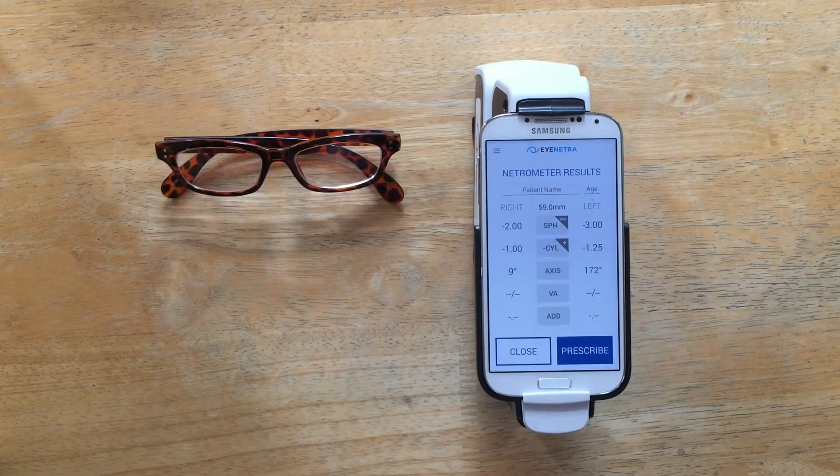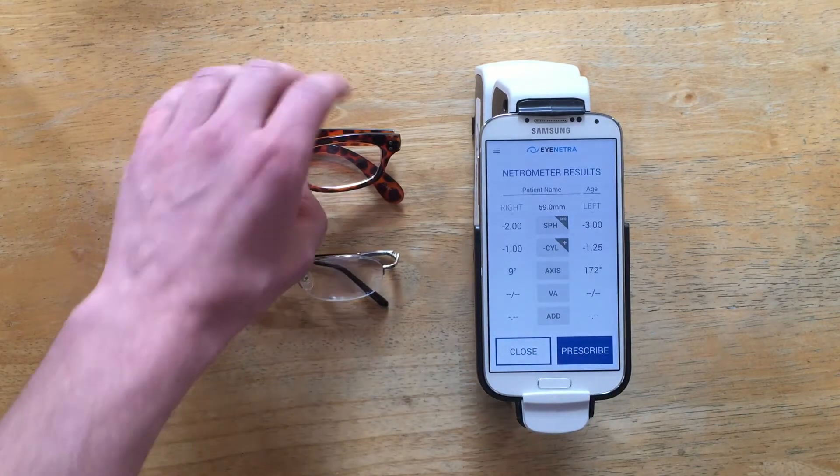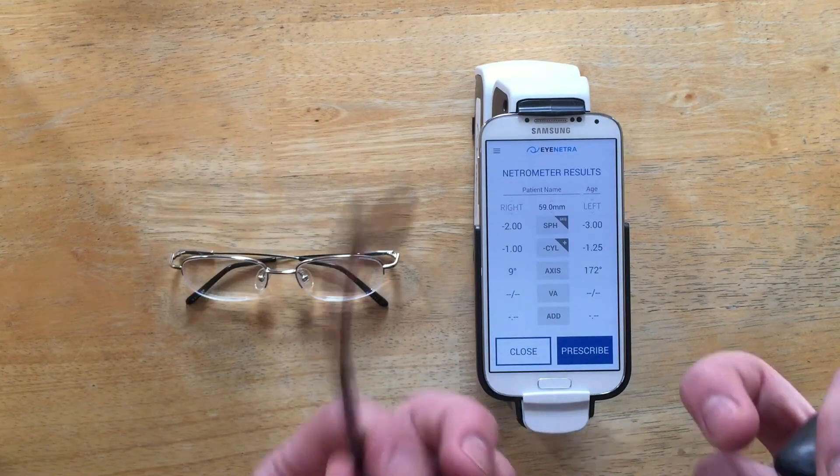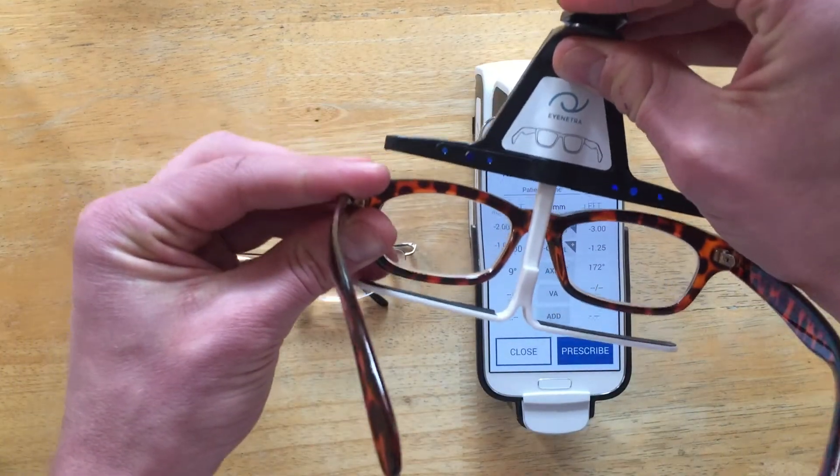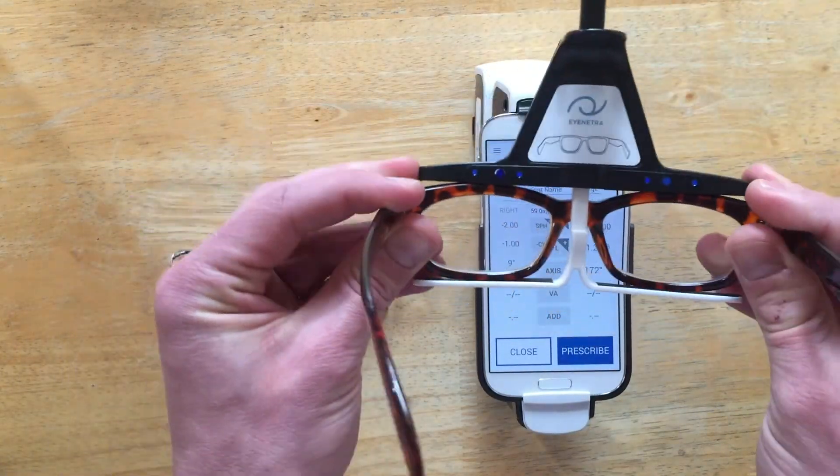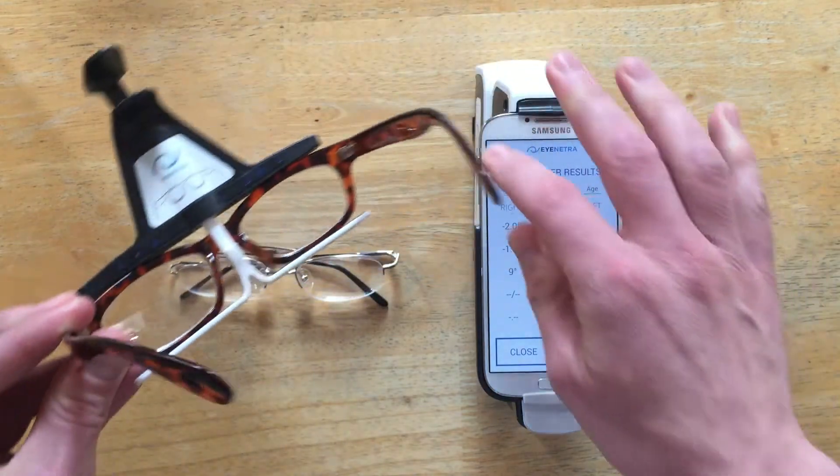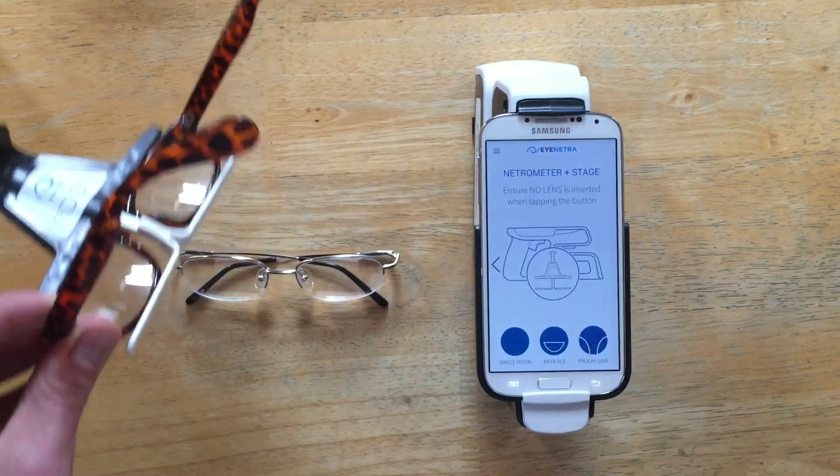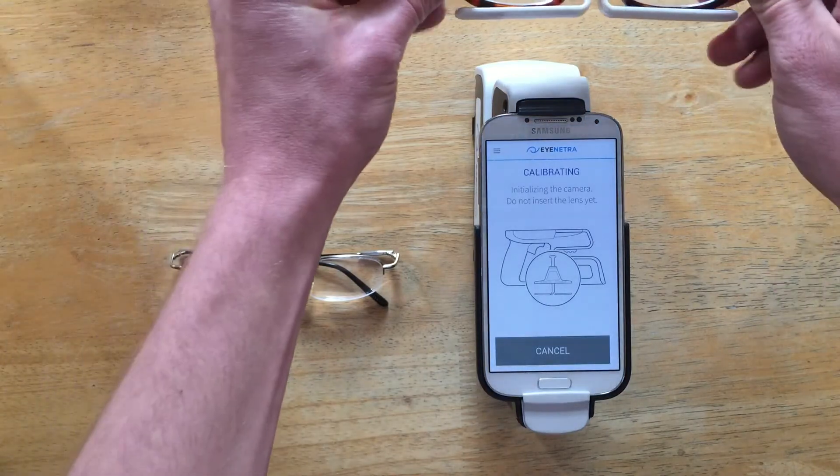The process is the same for progressives. There's simply two readings per lens instead of one. So I'll attach my Smart Stage to the progressives, again ensuring that the center post is centered on the bridge of the eyeglasses. I'll select Progressive mode, and then again proceed as normal.